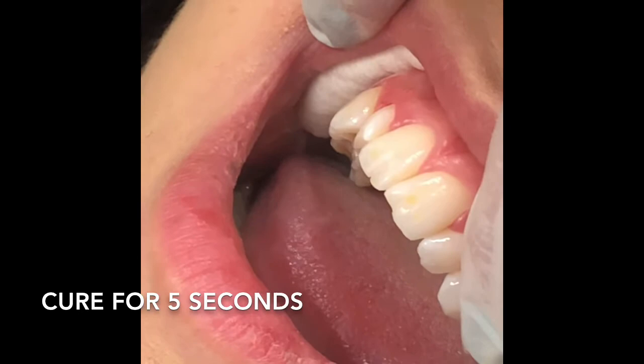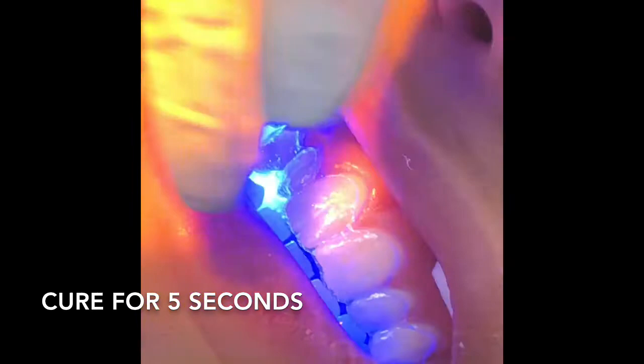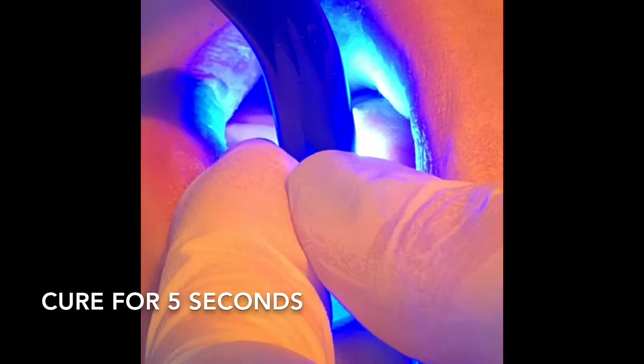The patient will bite down on their back teeth, and then she's going to do her final cure with the light coming in. We'll take this one out and that will be it for the video - we'll just do one arch. That lateral is super important but it's seated all the way on there - oh yeah, that's great.